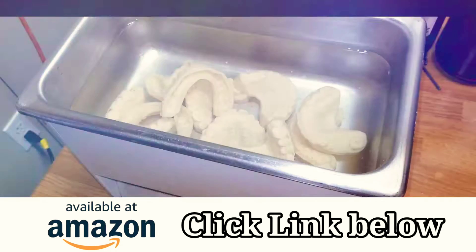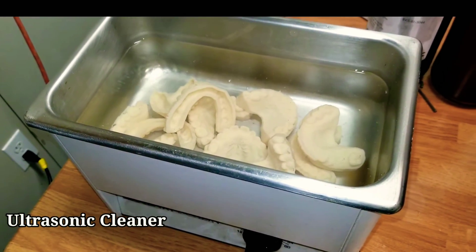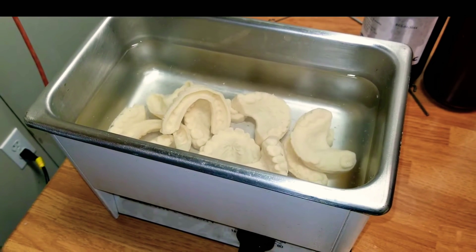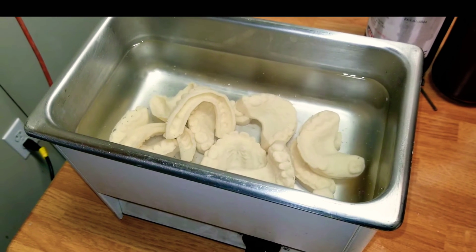I put the models in a clean bath. This is 99% IPA — you can buy this on my affiliate link, check out the link in my description below. I place these in there for about one minute.